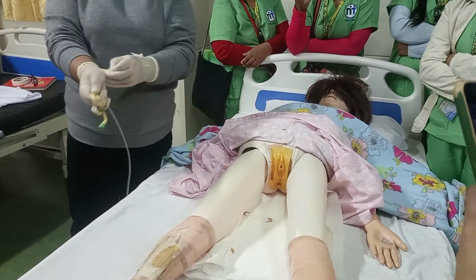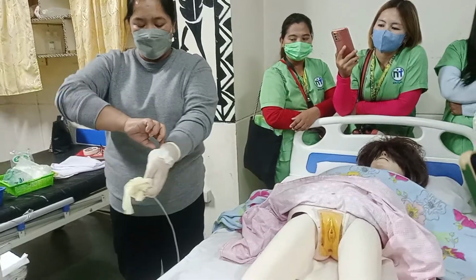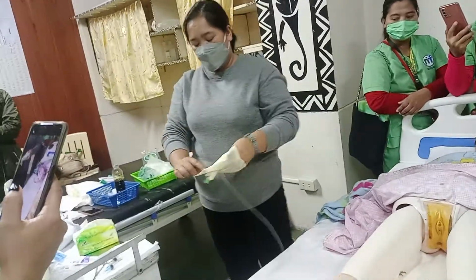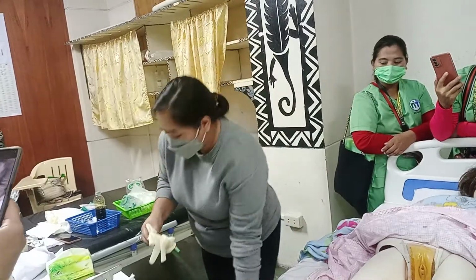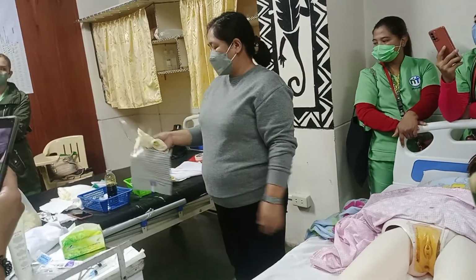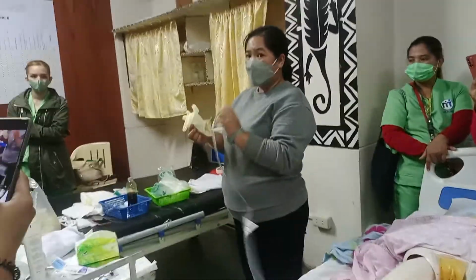You're now going to put it together with the gloves. Okay? Okay. And throw it in the, anong kulay? Yellow trash bag. Okay? I-check na lang ninyo kasi dito sa atin, syempre manmanuti basuraan, usually tinatanggal natin to.